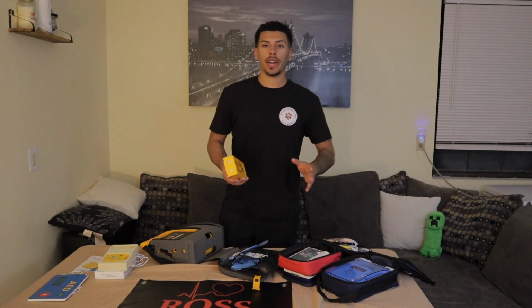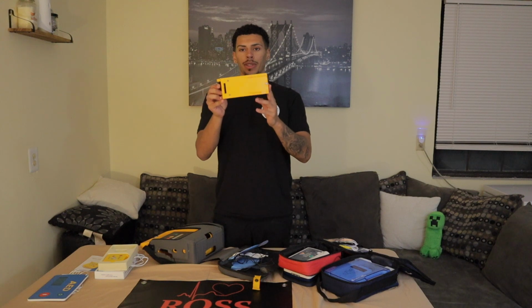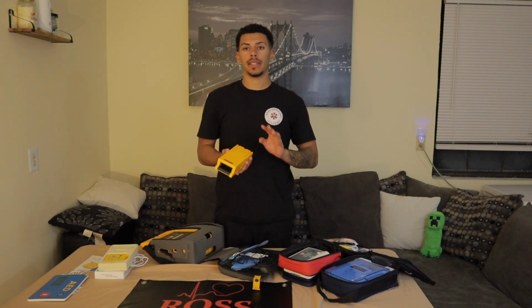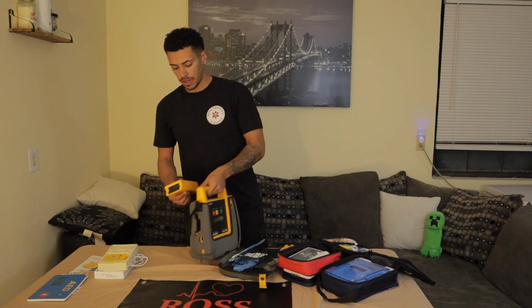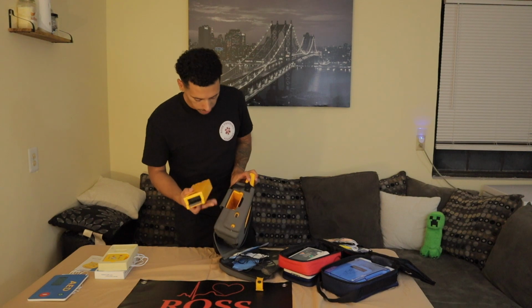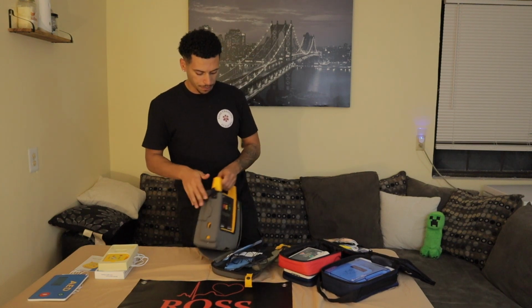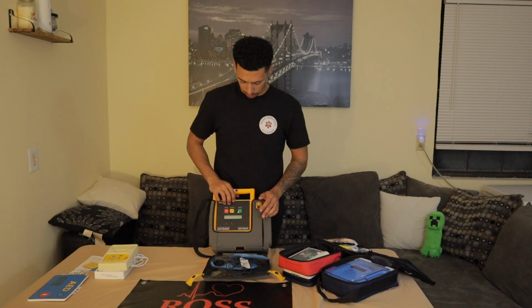Alright, sorry about that. The batteries were dead, so I had to replace them. The battery looks like this big old block here, but if you just unscrew it, there's 4 D batteries in there, and that's how you replace them. Then it slides in through this little Velcro flap, just like that. So now, let's go ahead and turn this thing on.